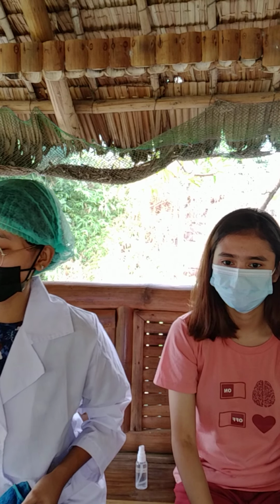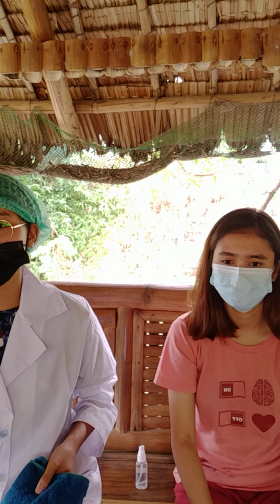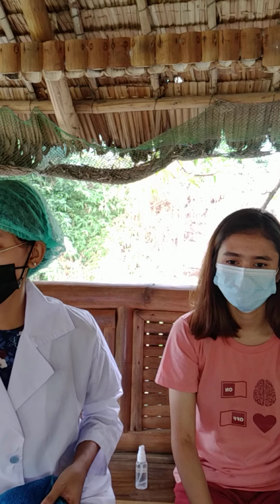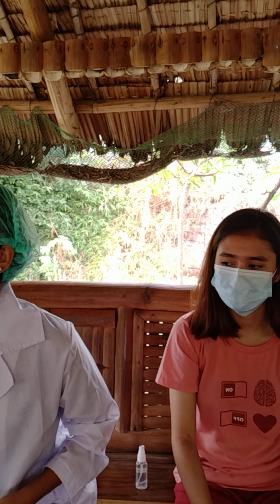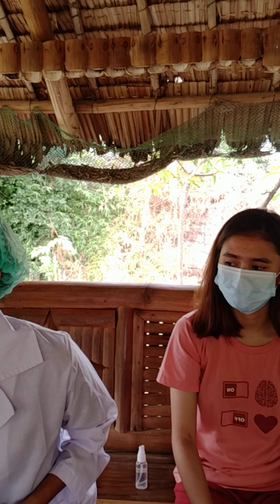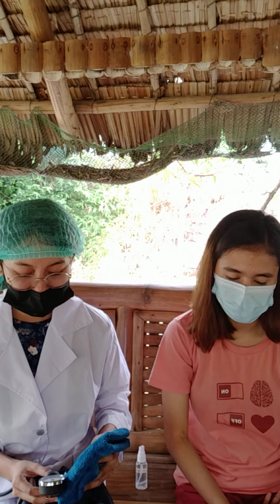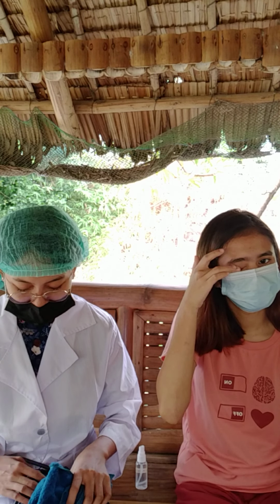And then after that is for the evaluation, so bago pa lang lahat is ililinisan din natin yung sphygmomanometer natin para matanggal yung mga microorganism na kumapit dito. Dahan-dahan lang tayo.